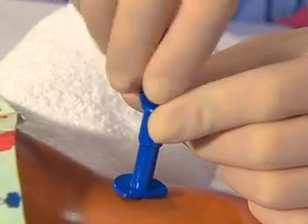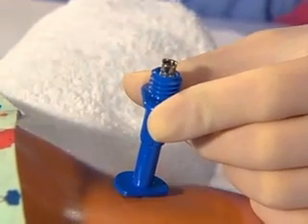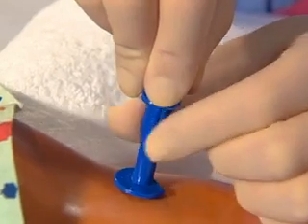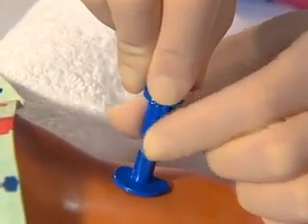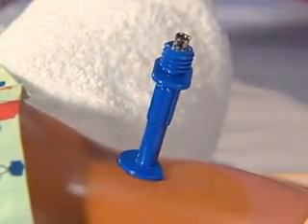Remove the needle cap and stylet. If the device has a supporting flange, adjust it so the surface is flush with the skin to stabilize the needle and to avoid inadvertent deeper insertion. Take care to avoid disrupting the needle while adjusting the flange.